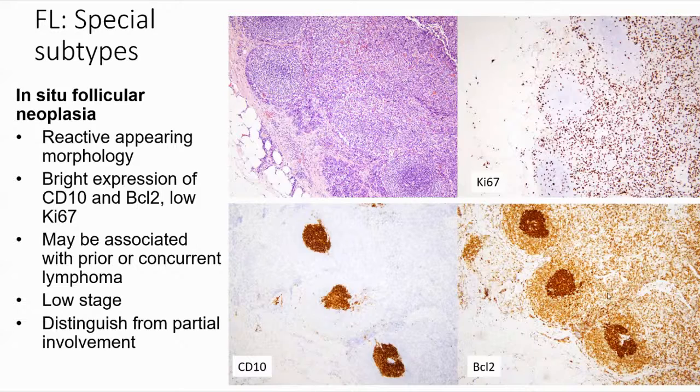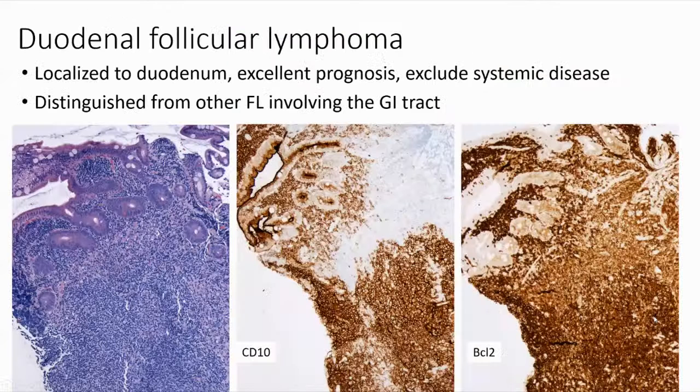You can see it in these CD10 positive follicles, and they will show BCL6 as well. So they usually look like a really nice follicular lymphoma, with nice CD21 staining associated with the follicles and low Ki-67. They distort the morphology a little bit, but they don't usually cause too much tissue destruction. People biopsy a vague nodularity that they see in the duodenum or something.